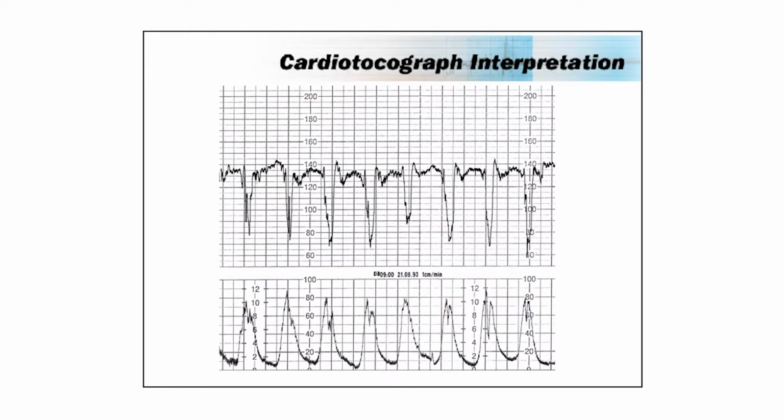Would you agree that sometimes you can understand why they are called early, but can you see why they are very clearly not early decelerations? The fact that they are all associated with the contraction is irrelevant. They meet the definition of a variable. They do not meet the definition of an early. Early deceleration is gradual onset, gradual recovery. None of them meet that criteria. Variable decelerations can occur anywhere in the contraction phase, including with the contraction. This happens here, okay?